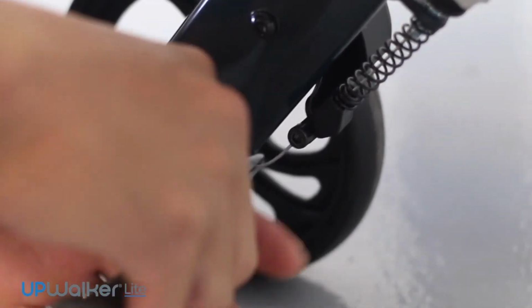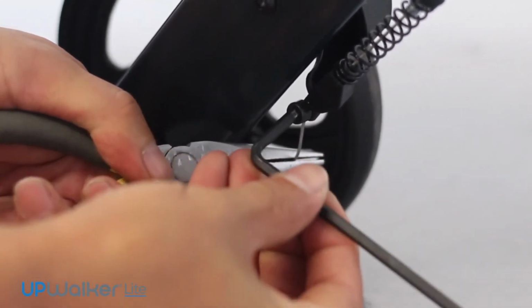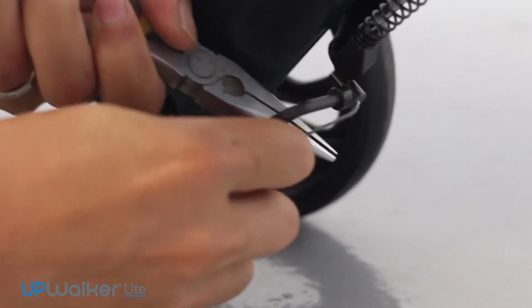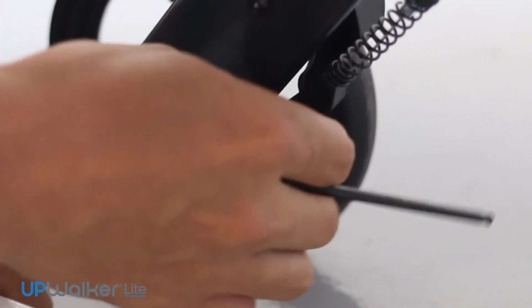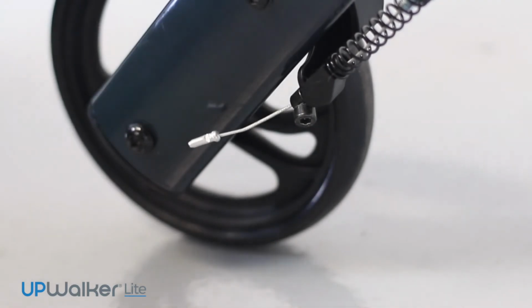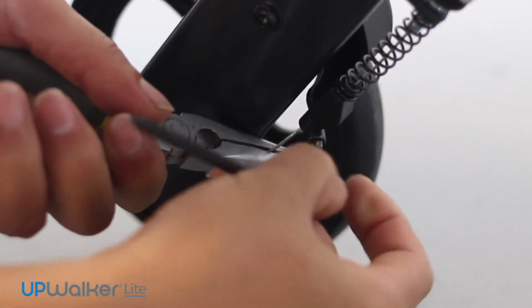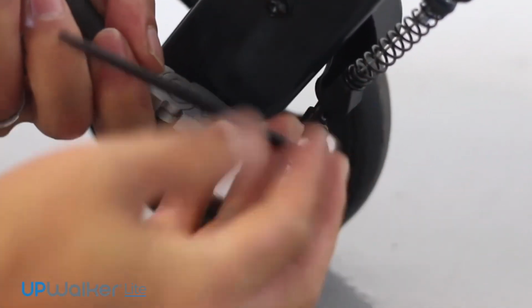If you cannot achieve the desired adjustment by means described for brake adjustments, you may have to go back down to the rear wheel, whereby you will use an Allen wrench to reset the brake cable using the brake cable set screw and nut attached to the brake cable near the rear wheel. First, loosen the set screw by turning it counterclockwise with an Allen wrench. Once loosened, pull the brake cable through the nut to tighten the brake, or push the brake cable into the nut to loosen the brake.